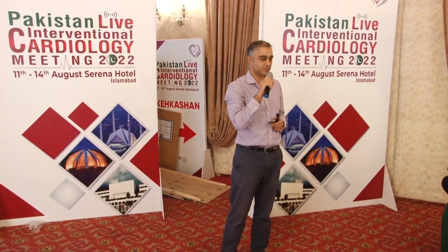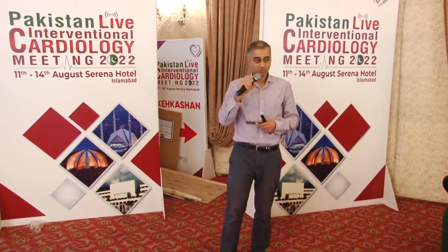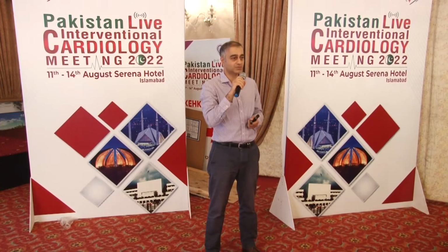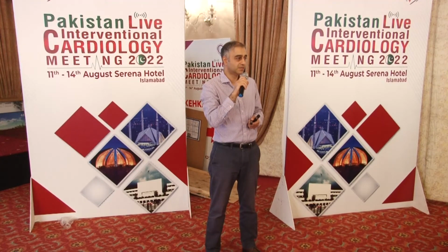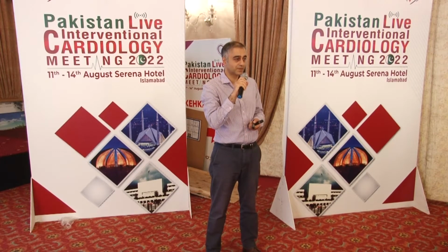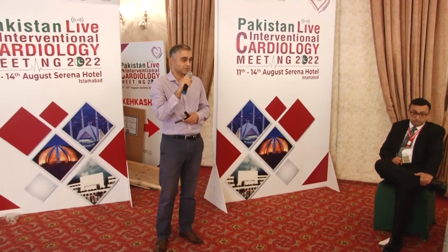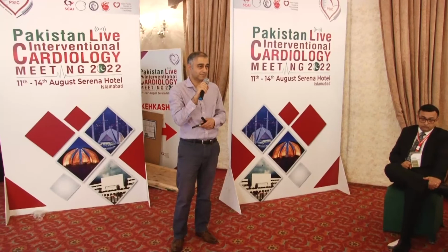So on the angiogram, you know that there's a lesion there, but you're not quite sure what it is. And when you have diagnostic uncertainty, that's exactly when you should be reaching for your IVUS catheter or some form of intracoronary imaging catheter to determine what's going on inside the vessel. There are a number of possibilities here. This could just be plaque disease, as you've said, or it could be a SCAD, but you don't know. And the management is going to be very different, isn't it? Because one of those you're going to want to treat with a stent, and one of those you're probably going to want to avoid stenting.